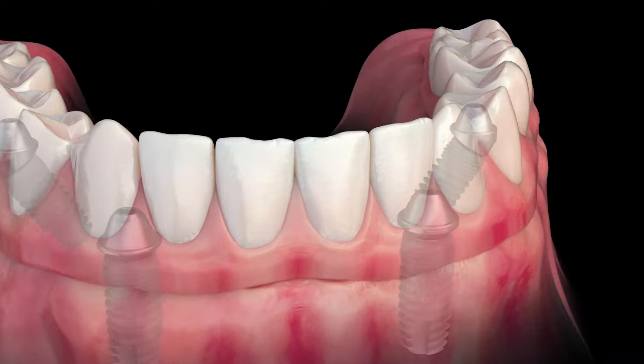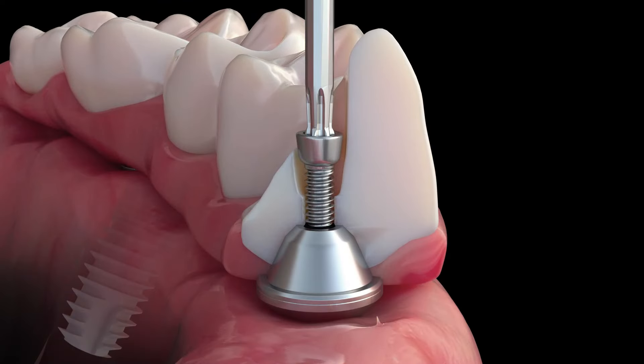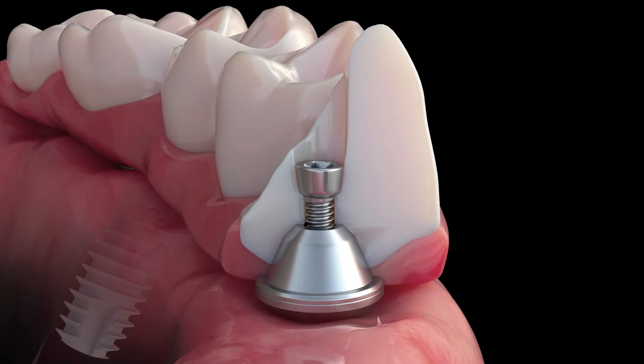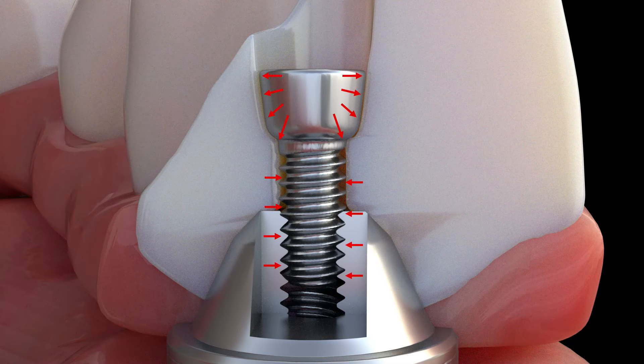The specialty screw can be used in many different situations. The first is being used with a multi-unit abutment. The specialty screw is placed into the multi-unit abutment, showing the stability of the lateral walls and the apical direction with the zirconia under the screw head.